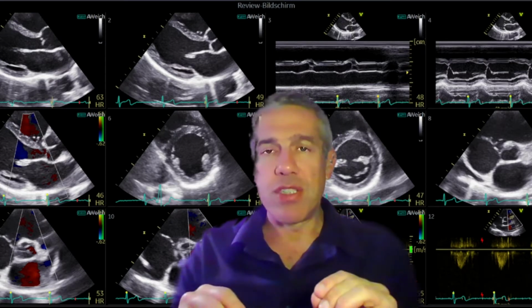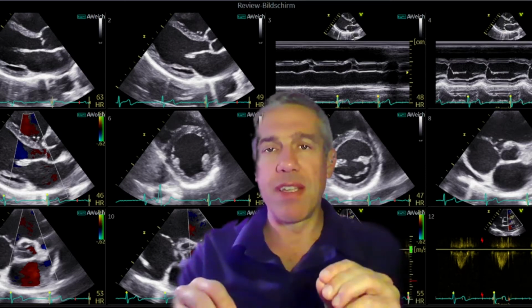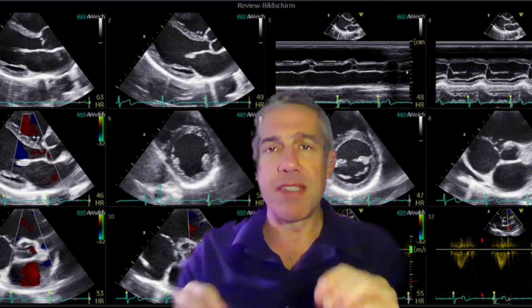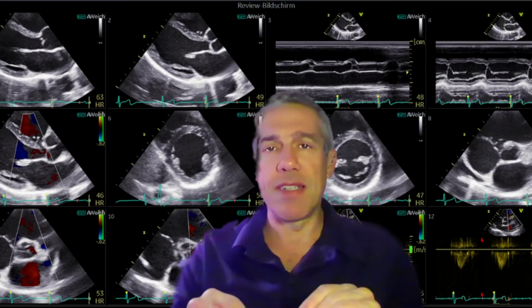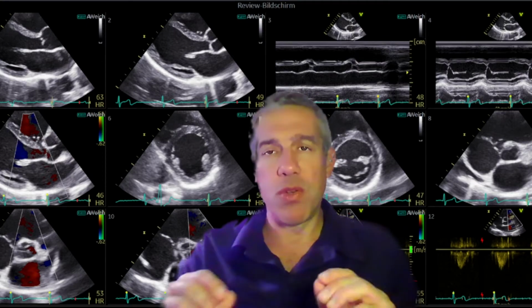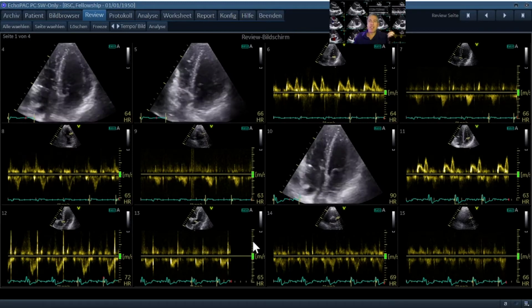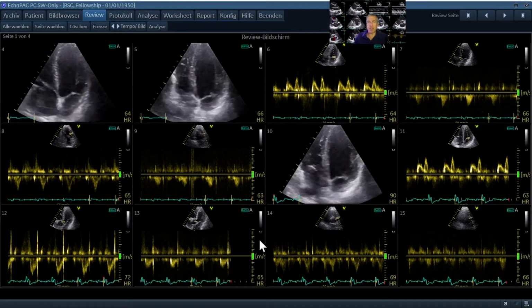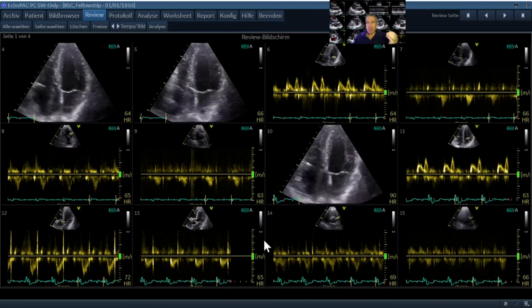In this situation, it is not always clear when you turn the pacemaker off if the patient is still in left bundle branch block, but in this case, this seems to be the case, and we will see that he is still dyssynchronous when we turn the pacemaker off. So what you see here are the images that we took during a session with electrophysiology fellows, which were on a course. We scanned this patient during the course.